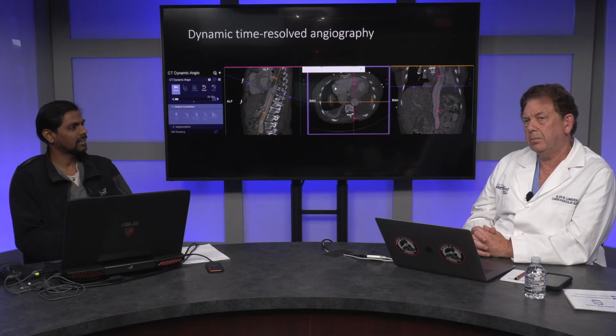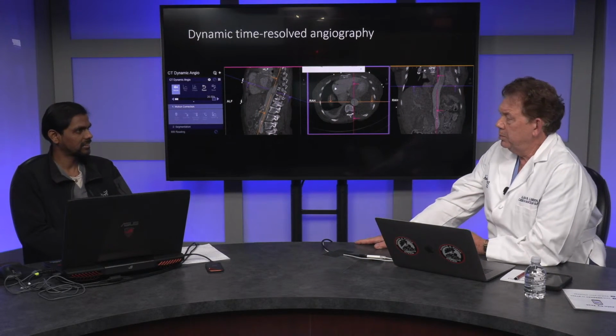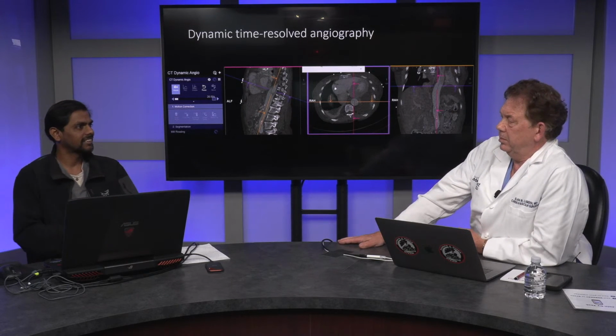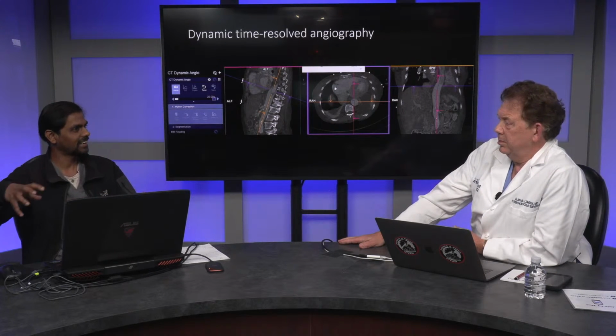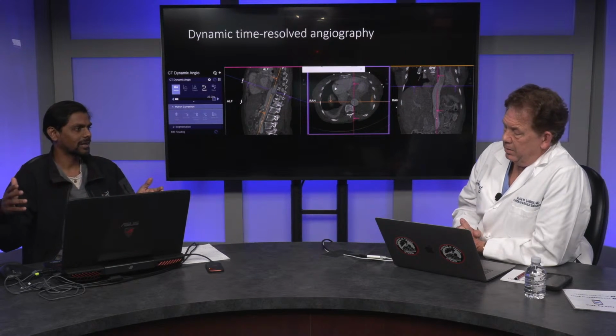The other approach is that the field has to also evolve, where currently I see a lot of gap between when a surgeon or an interventionalist orders an imaging study and when they get the images. There are a lot of missing links that have to be at the same level of information. Otherwise, with one mistake, the patient needs either a repeat imaging or has a suboptimal imaging, which has to be somehow offset or complemented by intraoperative imaging or additional contrast in the OR.